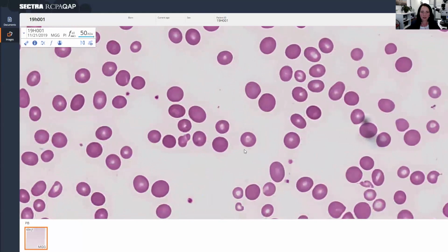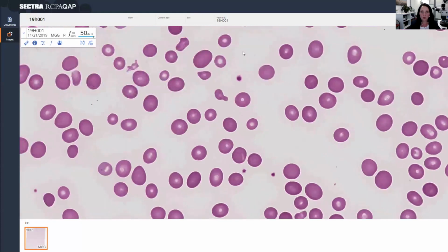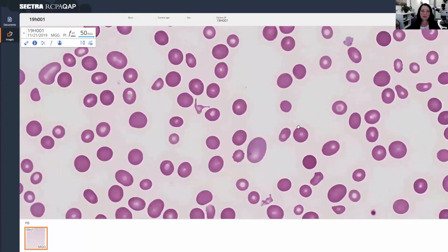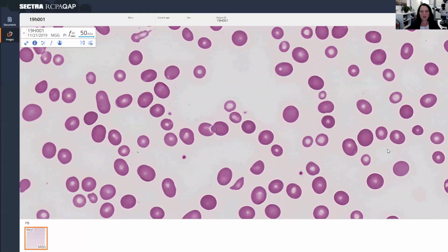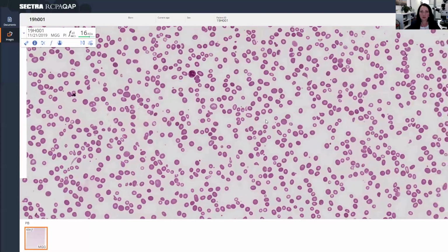We haven't really talked about the platelets. So platelets reduced in number, they look pretty normal really. There's no big hypogranular platelets, nice big macrocytes, but overall the platelets look pretty good. In terms of a differential for this film, I would say that megaloblastic anemia is by far and away the most likely differential, with medication as a possible differential, and then maybe MDS as a less likely differential.